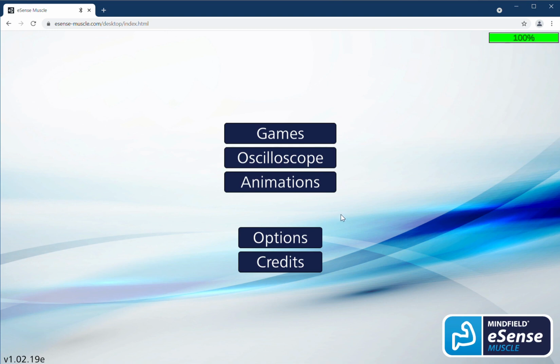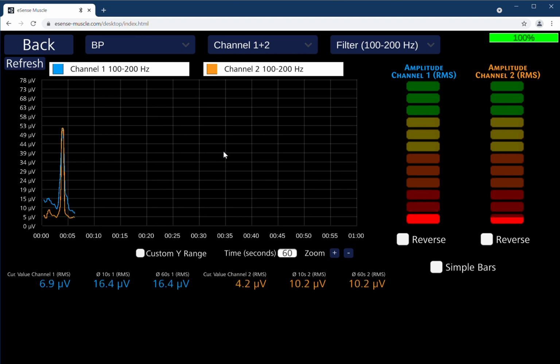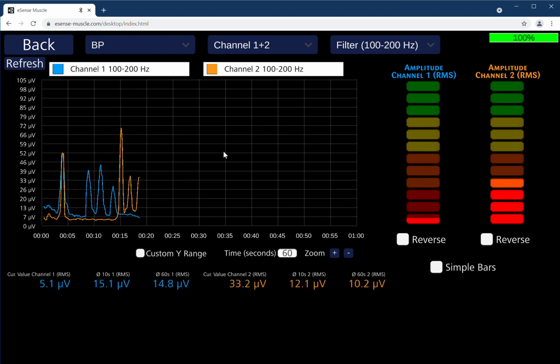You have some games to choose from. You have an oscilloscope view, some animations, and the options where you can change settings later on. So first, I want to show you the oscilloscope. And here you see now we have two lines, one blue line for channel 1, which I'm contracting now here, you can see. And we have channel 2 going up and down here when I contract the muscles of my right arm. I can do that both together.